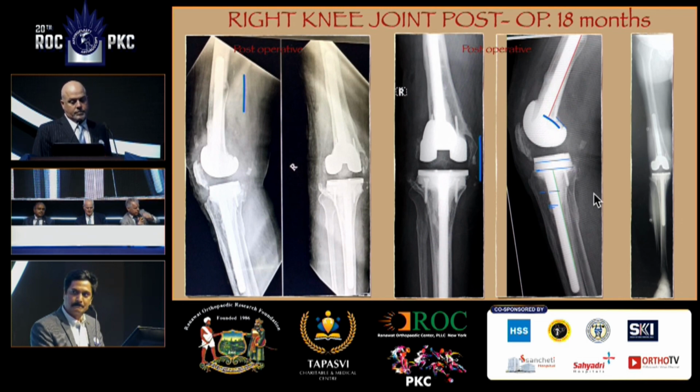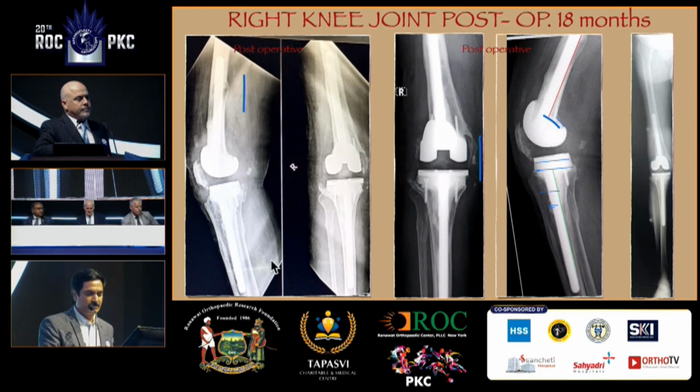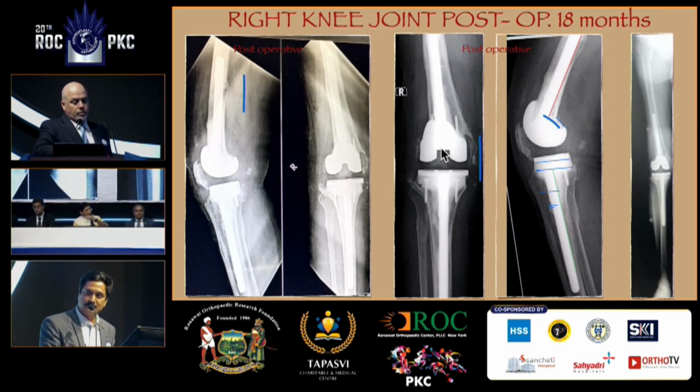What about the screws? Can you explain the screws to me? Why didn't you build up the femoral component? Leave the tibia at the same level, then you have a good joint line. No, these are the primary implants, PFC design. So we only have the option of a maximum 17.5 poly. If you go down on the tibia, you need more, meaning constrained poly. No, he's saying, why did you not distalize the femur so that your joint line is restored rather than raising the joint line by taking the femur so proximal?